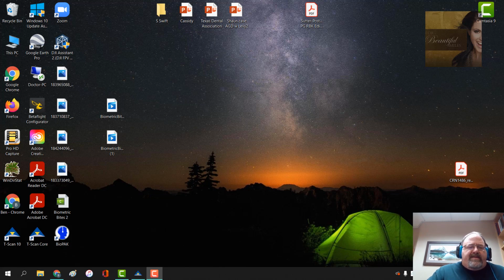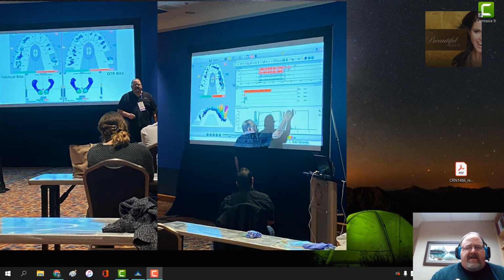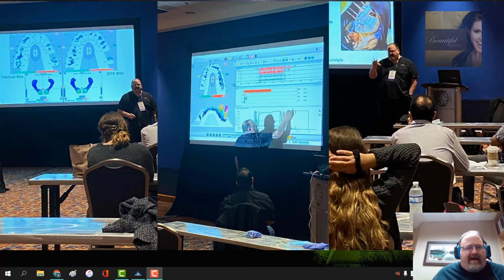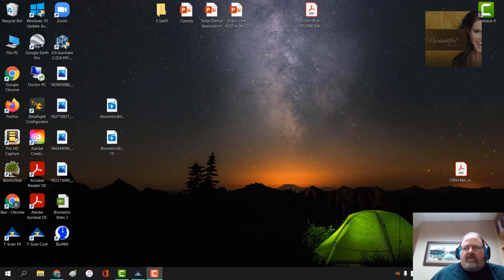Okay, so 2 weeks ago, I presented a couple of courses at the Texas Dental Association meeting in San Antonio, and I did touch upon settings a little bit, but in the last 2 weeks, I've gotten a couple of direct messages and some emails asking me to go over those settings because I didn't spend a lot of time on it. And unfortunately, when you're just given an hour, you don't get a lot of opportunity to go too far down the rabbit hole. But I will revisit that now.